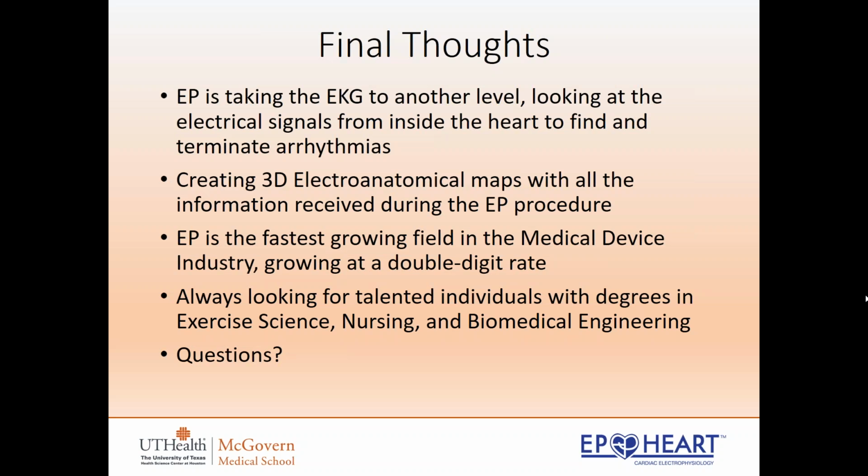Sometimes if they do, they'll feel arm pain, like heart attack arm pain, kind of shoulder pain, and as soon as we stop burning, it goes away. So it's a pretty easy procedure, I should say, regarding the patient. I mean, they come in, it's exactly like a heart cath. We're going through the same area, through the groins up into the heart. So most of the time, they will stay the night just to observe for the night, but other than that, if it's an easy procedure, they may even go home the same day. So that's kind of what they can expect to do an EP procedure.